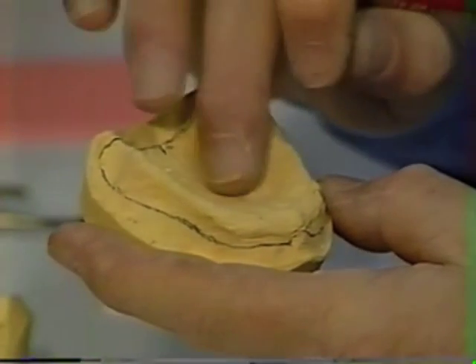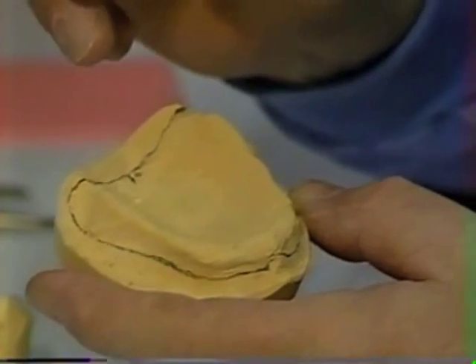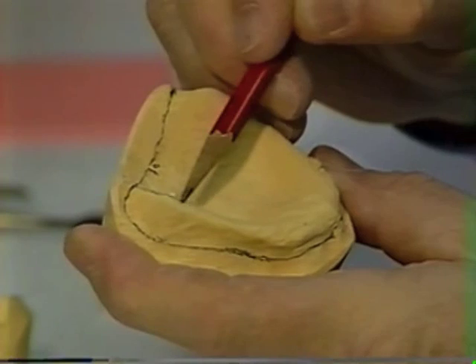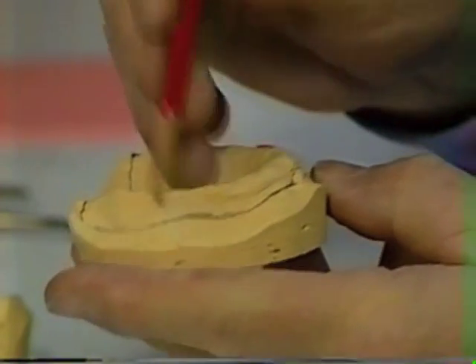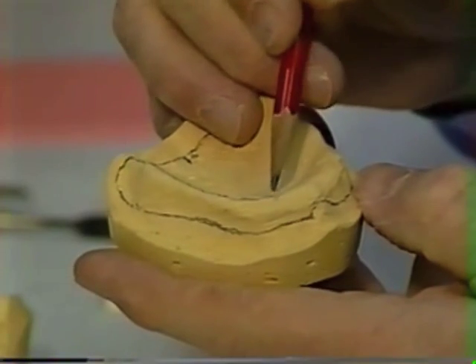But if you don't have a torus and it's just nice and flat, then we can use that entire palate as a stop for our tray. So as a consequence, what we want to do is place wax for relief from the crest of the ridge facially, leaving the palate as a stop for the tray.